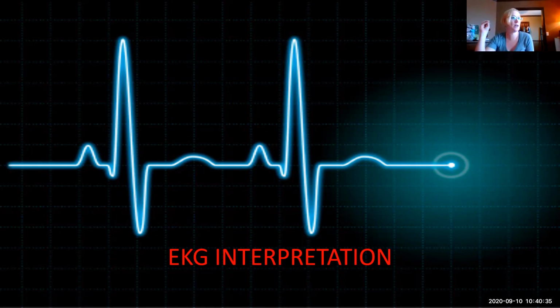If the monitor is alarming V-Tach, and you go in and check on your patient, and they're talking to you and perfectly fine, you might want to double check their leads and make sure their leads are accurate. Or if it's saying asystole and they're talking to you, well, you definitely know it's not accurate. So always treat the patient.